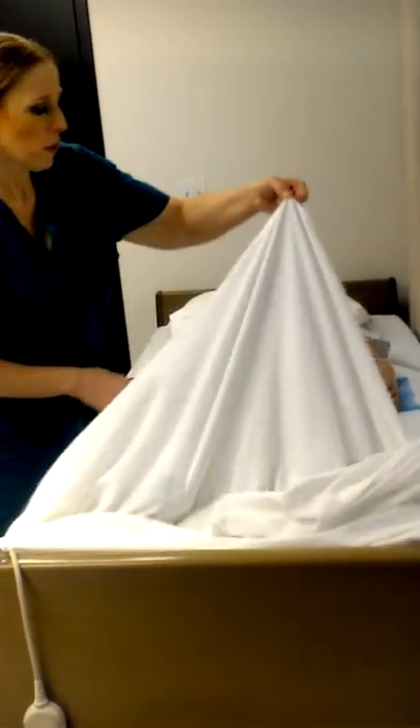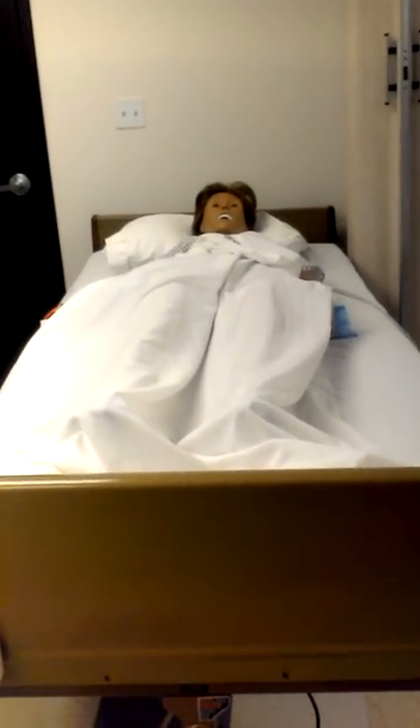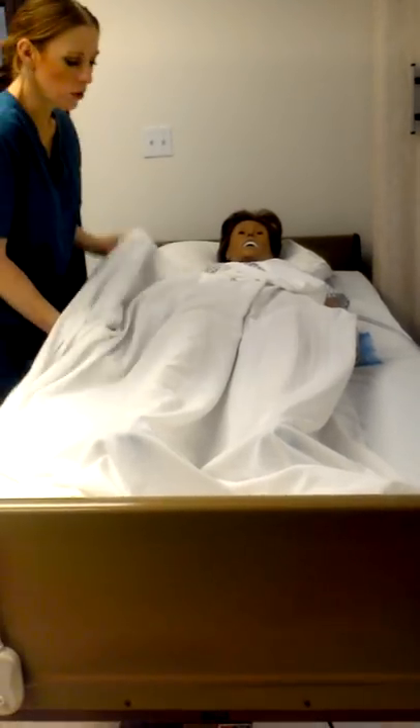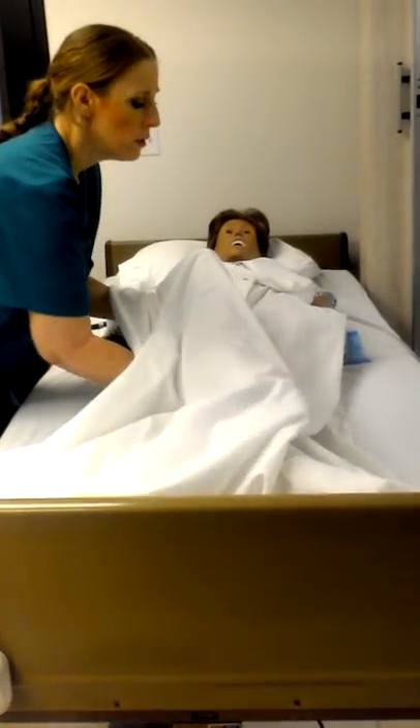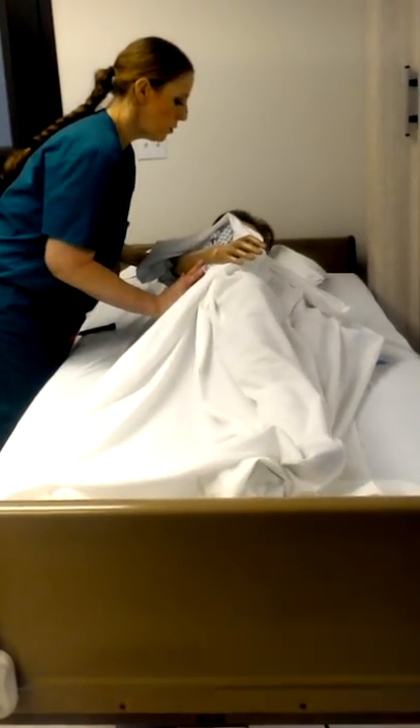Two fingers — only two fingers. Pull the towel out. All right, Mrs. Chase, I'm going to turn you on your side. Cross your arms. One, two, three.